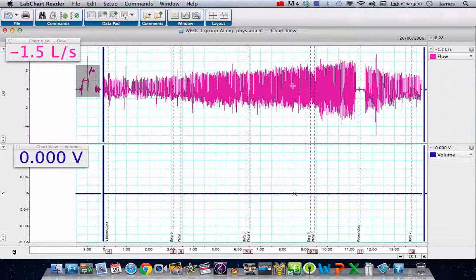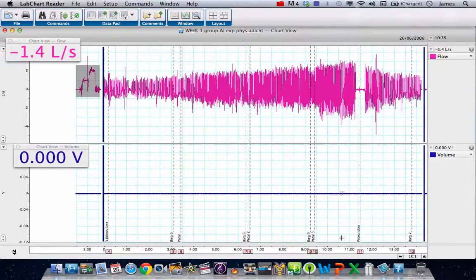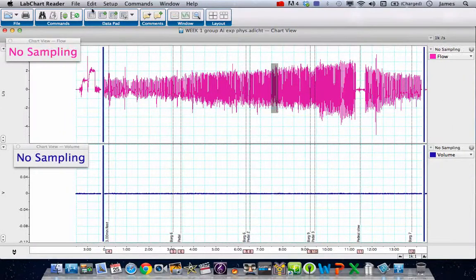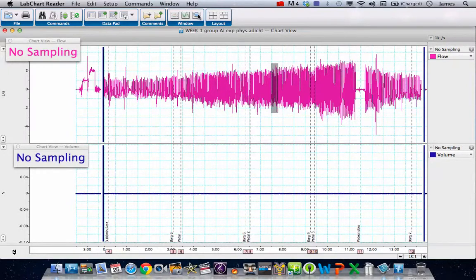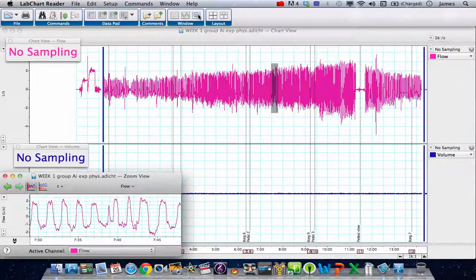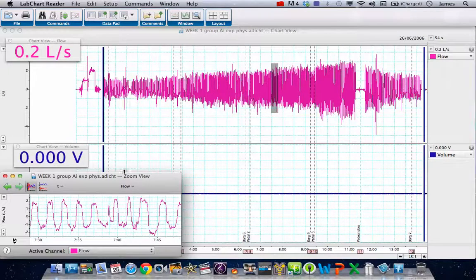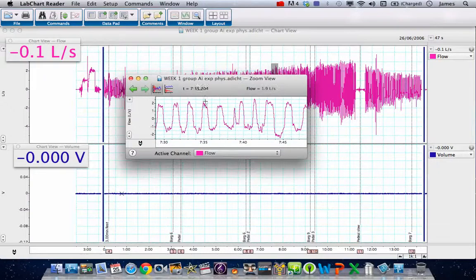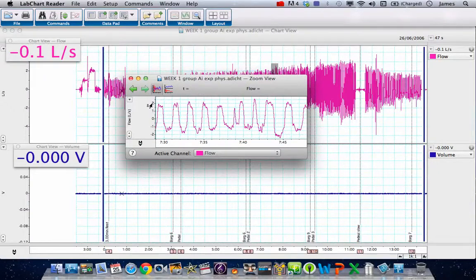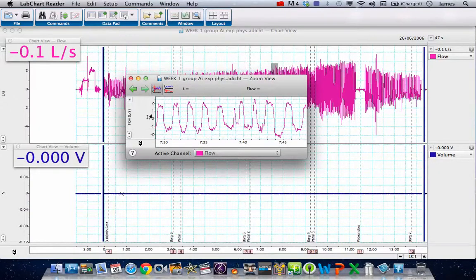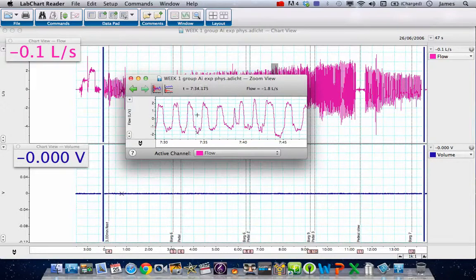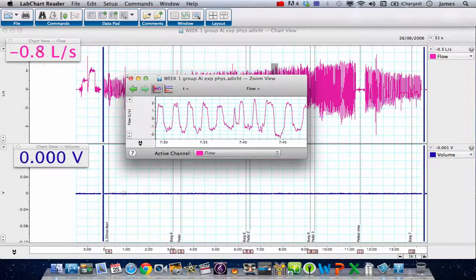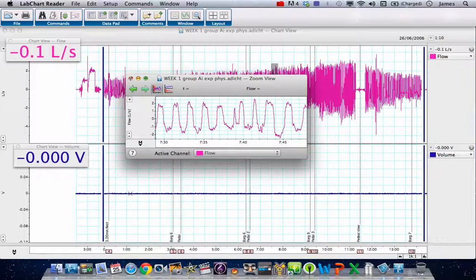Now our data here is calibrated. Let's zoom in on a very small section using the zoom window, and we can see that the flow is now calibrated. We've got in the scale bar here from zero to two and then from zero to minus two. Here is our flow rate as the person's breathing in and out. You can see it's clearly calibrated now, which is great.